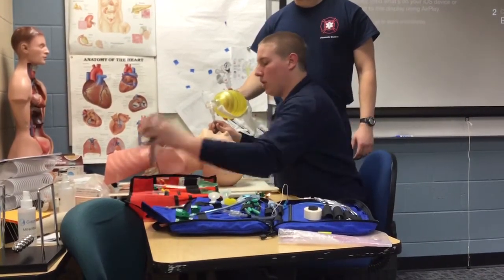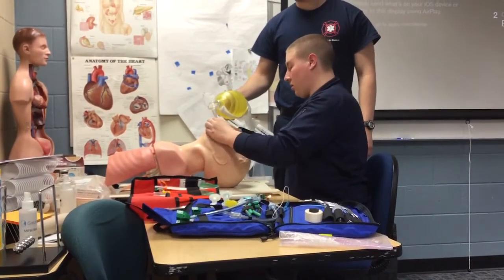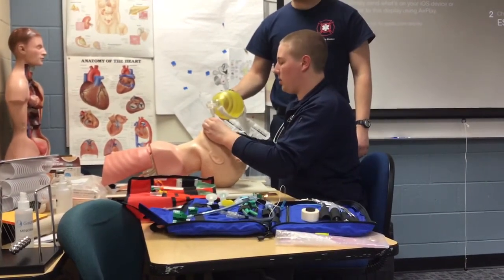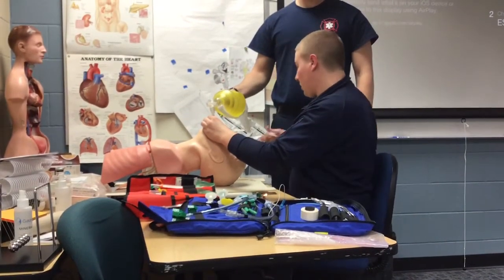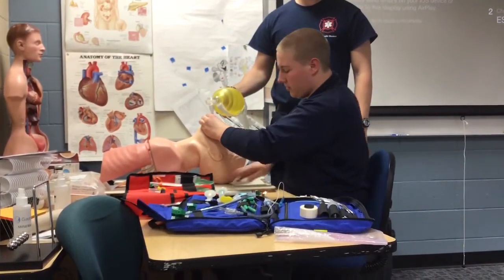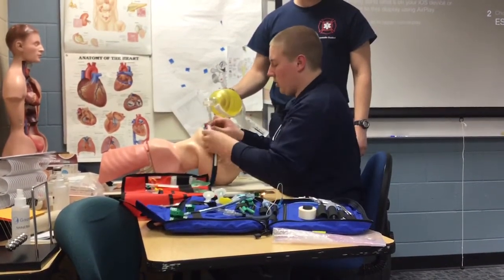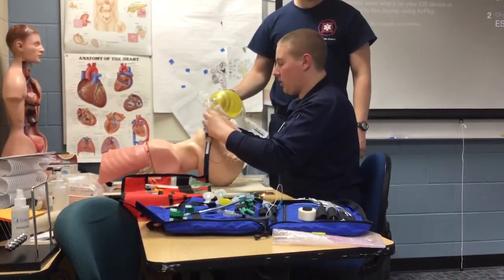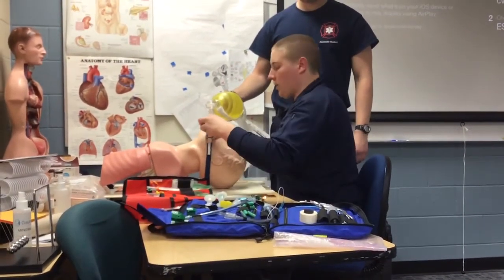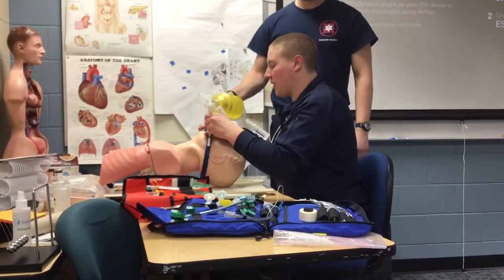So next you would grab your securing device, place it, come on to secure it, and then you secure it, and then you would continue breathing for your patient, one breath every 5 to 6 seconds.